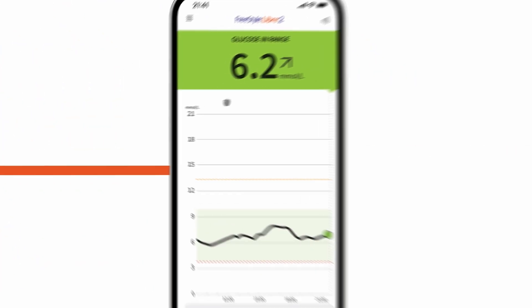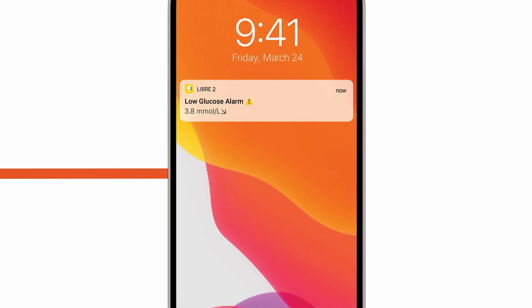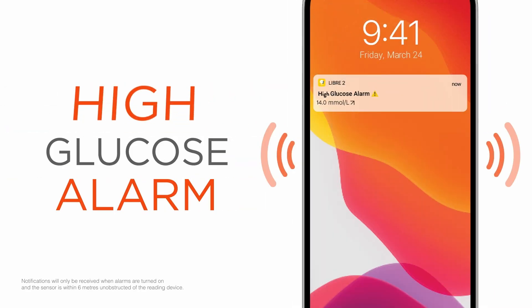That quick one-second scan or view shows you your current glucose, trend arrow, 8-hour graph, and glucose message. You can see where you've been, where you are, and where you're going. The FreeStyle Libre 2 system also has optional real-time glucose alarms that tell you the minute your glucose is too low or too high, even at night.